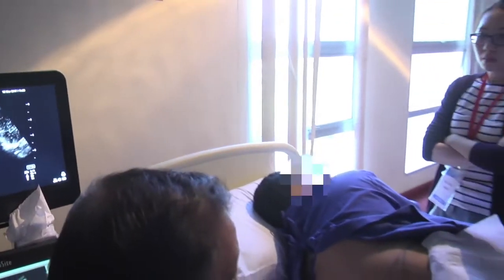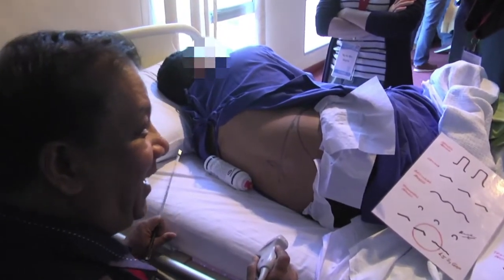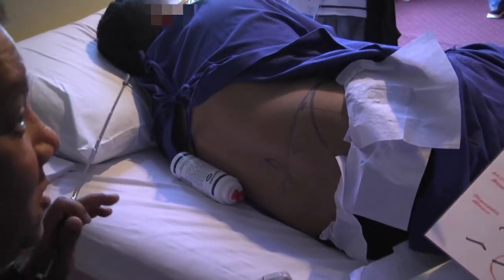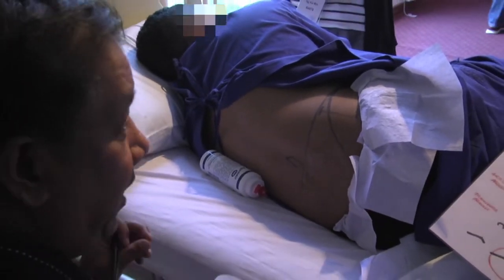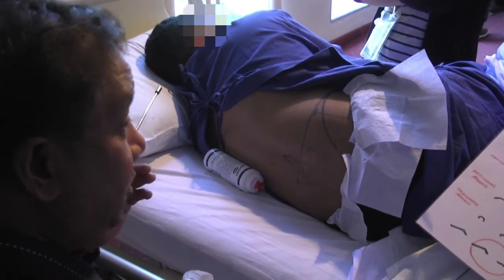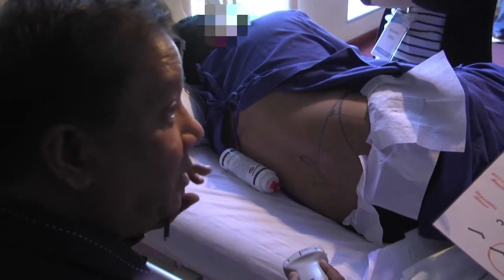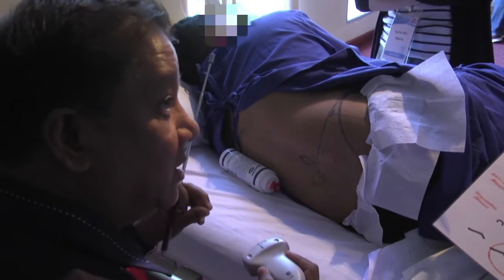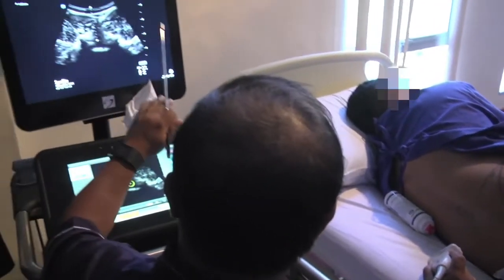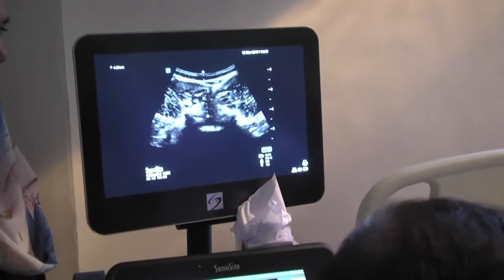It's like somebody saying, if I go past 4.29, what should I do? I said, I don't know. I would go further. But up to you, you just use your common sense. If you're doing a spinal, you need to see the CSF efflux. If you're doing epidurals, the ultrasound is not going to tell you the needle has entered the epidural space. You still have to use loss of resistance. So that's one limitation. So these are by far what you can use the transverse scan for.